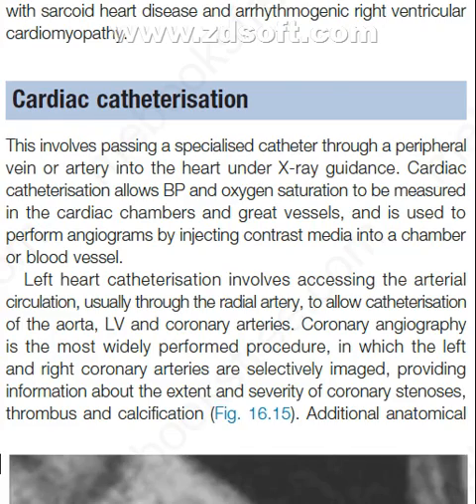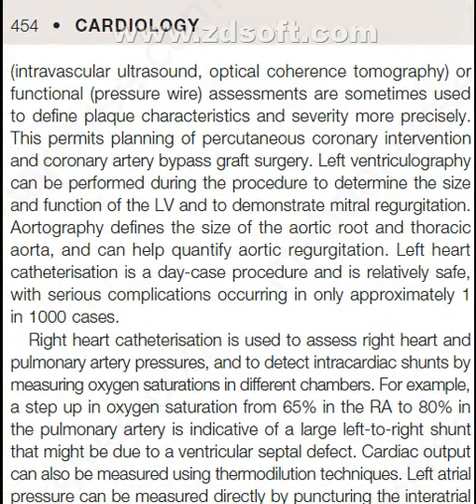Additional anatomical, intravascular ultrasound, optical coherence tomography, or functional pressure wire assessments are sometimes used to define plaque characteristics and severity more precisely. This permits planning of percutaneous coronary intervention and coronary artery bypass graft surgery.